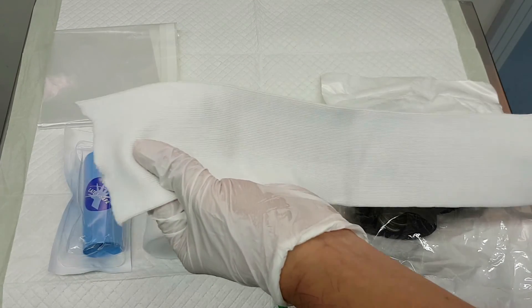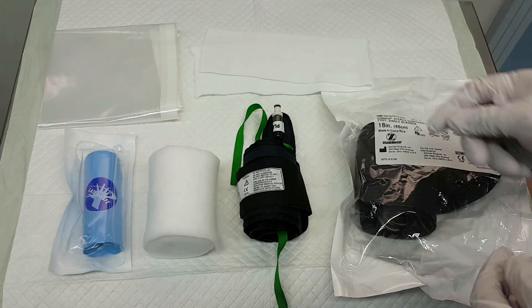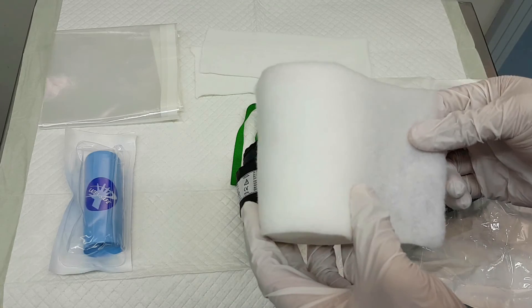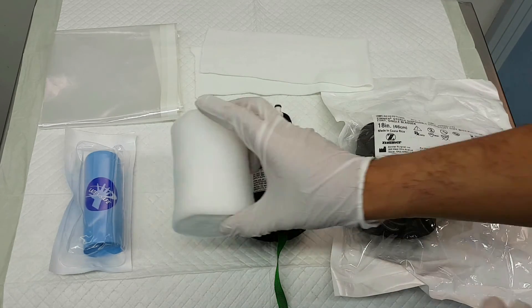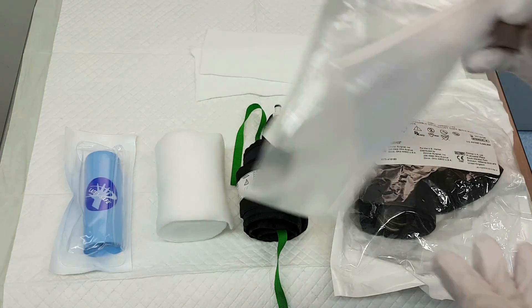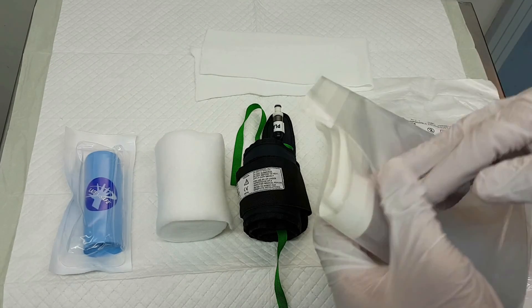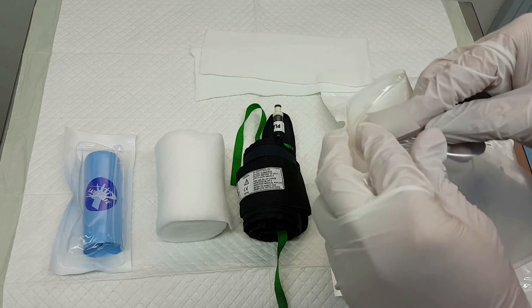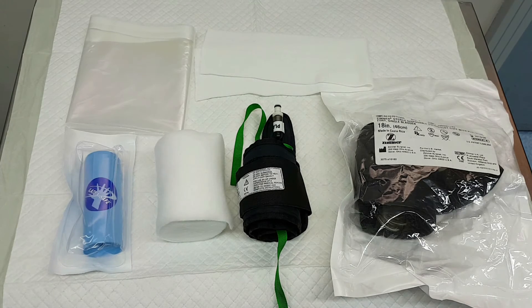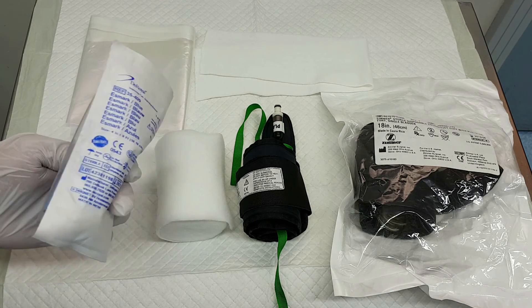An appropriate size and length of stockinette for skin protection should always be handy. Soft padding should be ready if the limb is conical in shape or if you don't have the appropriate stockinette size. Also have a plastic barrier nearby if the surgical site is close to the tourniquet to prevent soiling and fluid accumulation under the cuff. Finally, a rubber or elastic Esmarch bandage should be available for exsanguination of the limb.